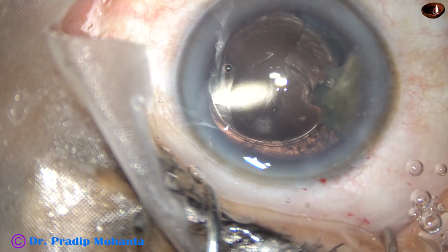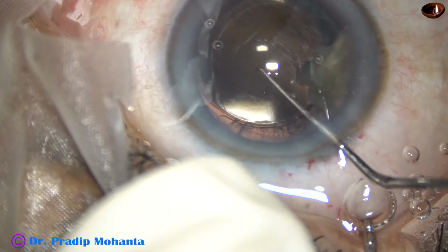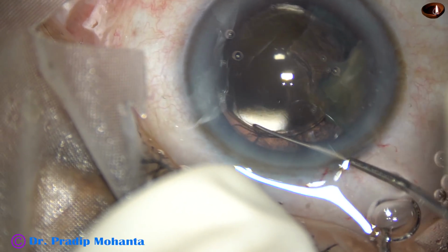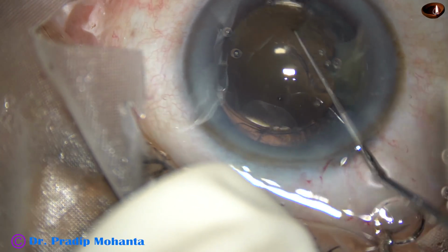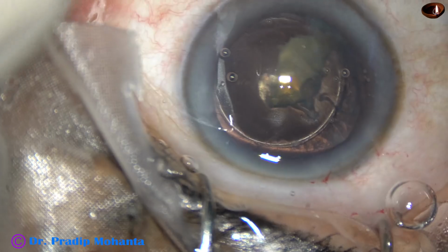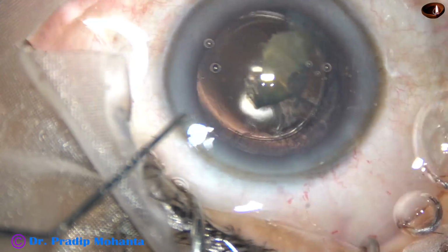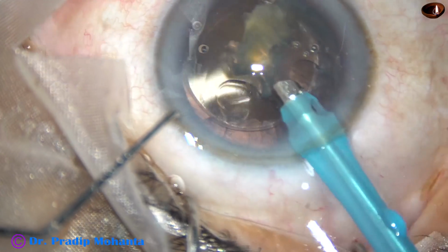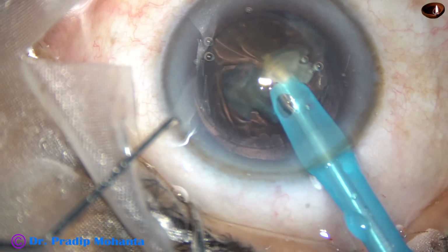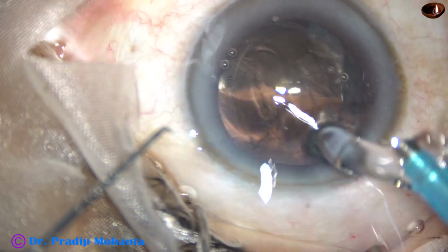I take a Sinskey hook at this time, and after checking the anterior capsular rim and being sure that the lens is in the bag, I bring the nuclear piece at the center, and then I emulsify this nuclear piece being right at the center at the iris plane, and it is done.